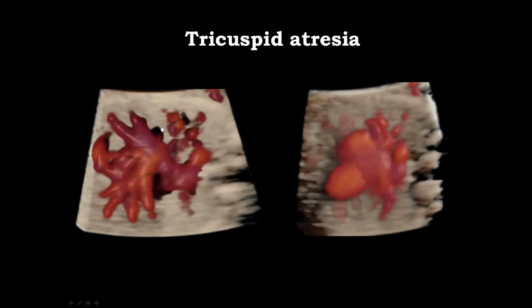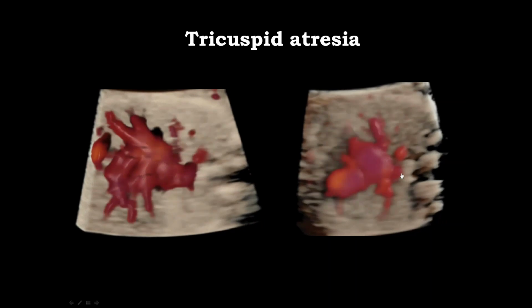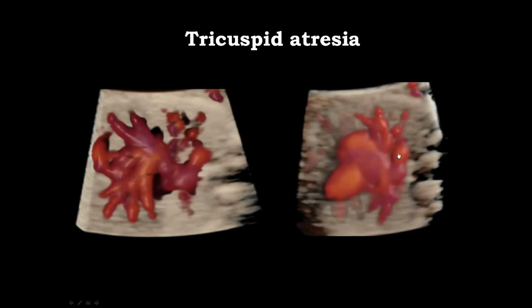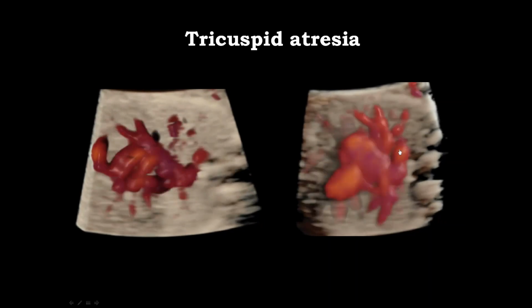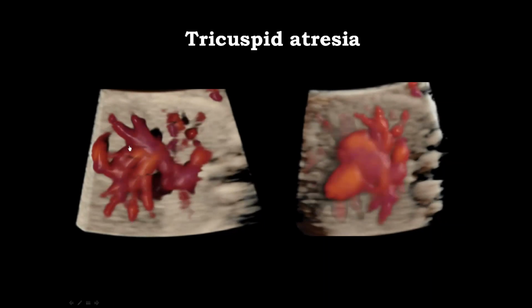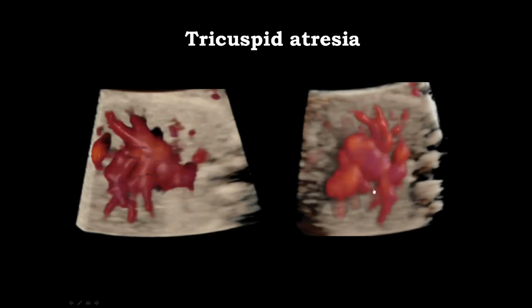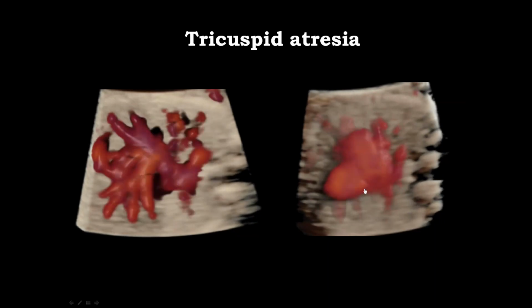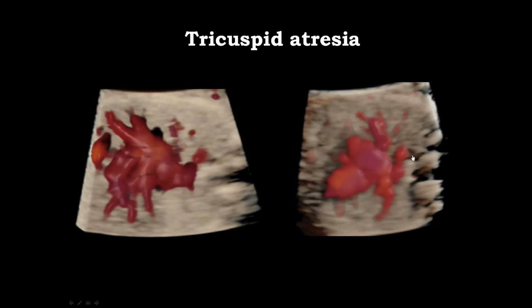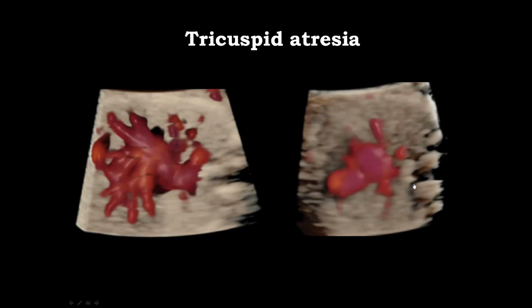This is abnormal vasculature at the level of the liver, and this big vessel next to the descending thoracic aorta that you can see behind, and this is indeed the dilated azygous vein. And here we can clearly see that on top of the very significant and severe cardiac anomaly, we have the anomaly of the venous system consistent with the interrupted IVC with azygous continuation.